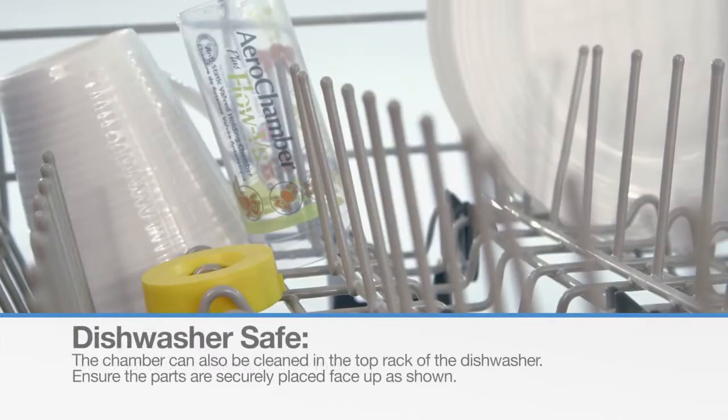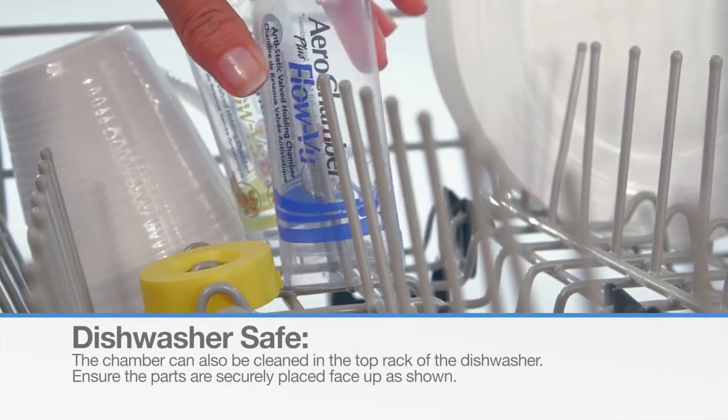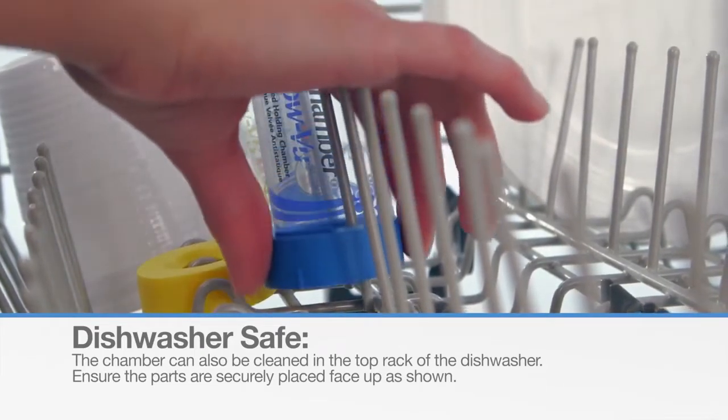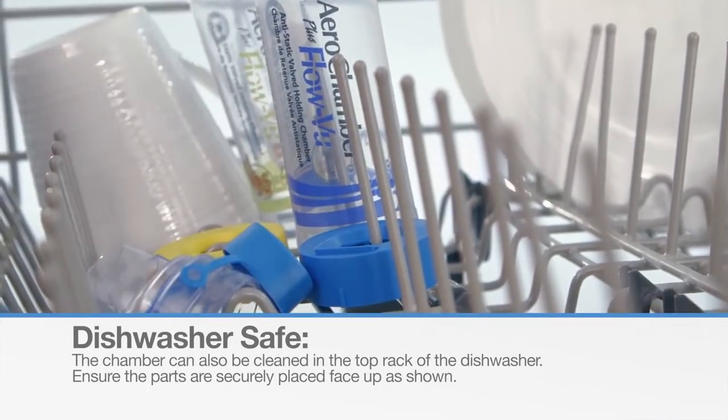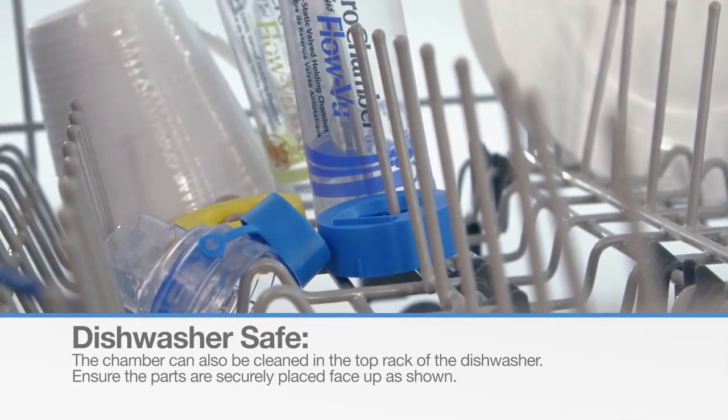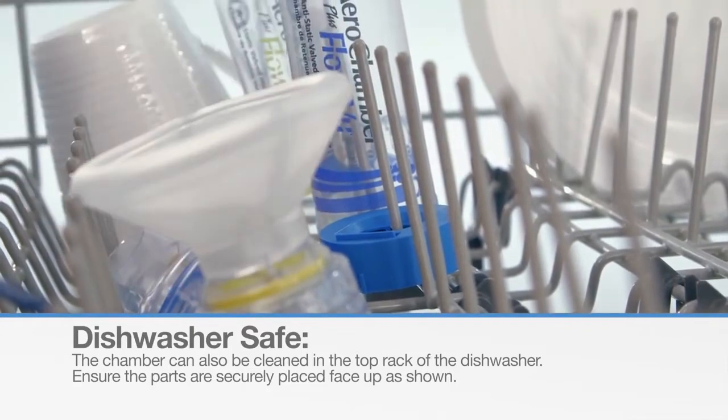The AeroChamber Plus FlowView Chamber is also dishwasher safe. If cleaning in a dishwasher, place the parts securely on the top rack. If using the face mask version, ensure it is placed facing upward as shown.